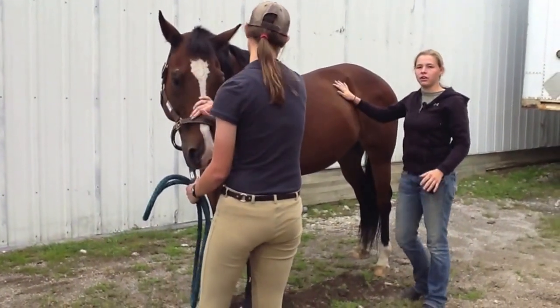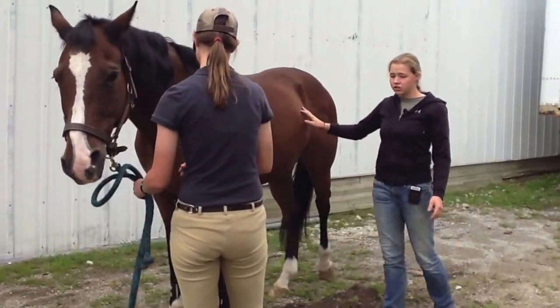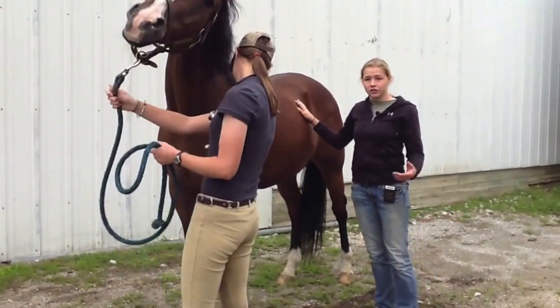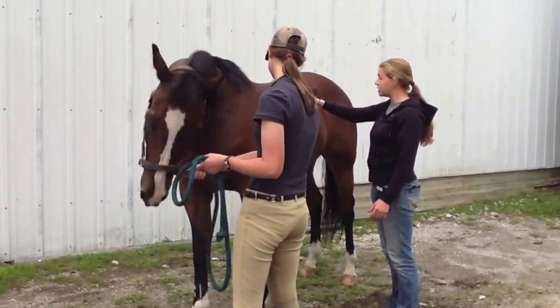Okay, so I got a count of 4 there. Again, multiply that by 4. That gives me 16, which is within the normal range of 8 to 16. Again, turnout or exercise can also raise that. So the next thing I'm going to check is his gut sounds.